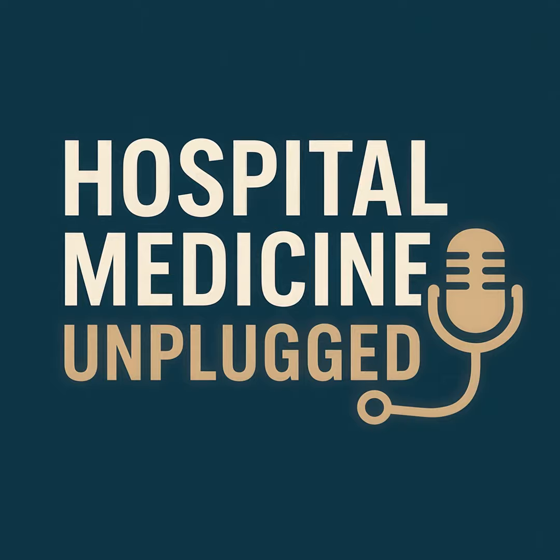It feels restrictive. Yeah, it can feel restrictive. It can cause discomfort, maybe persistent dry mouth, or even aerophagia. That's where they swallow air, leading to bloating and discomfort. So BiPAP helps there because it drops the pressure during exhalation down to that lower EPAP level. That lower pressure makes it easier to breathe out, requires less muscle effort. And for some patients, that translates to much better comfort and, well, they actually use the machine.